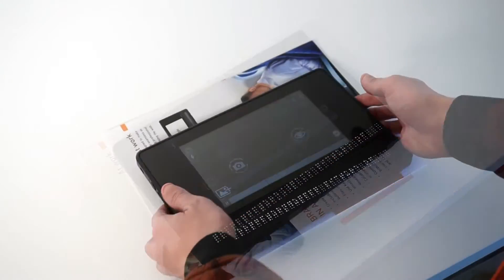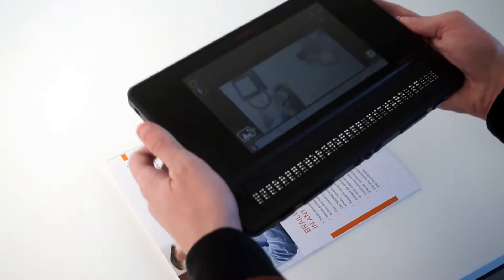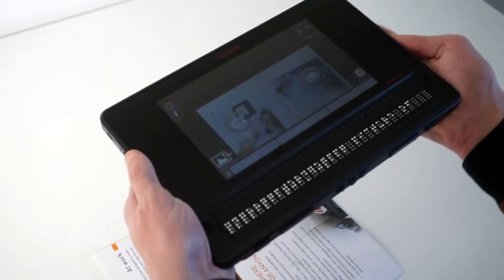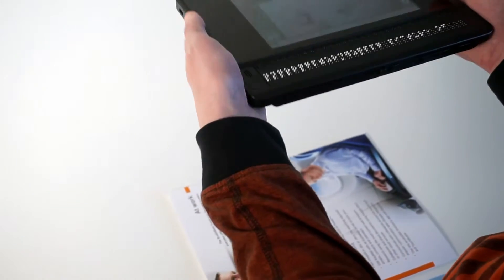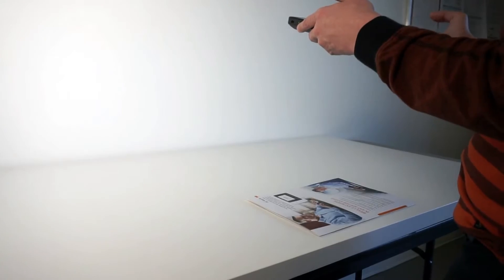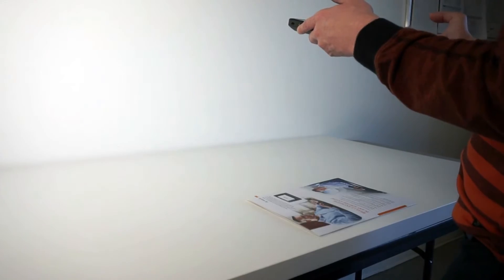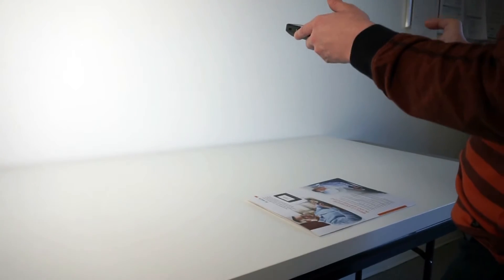Once in the application, position your BrailleNote Touch on top of your piece of paper that you want to take a picture of. Now lift it straight up in the air about 30 centimeters or 1 foot.